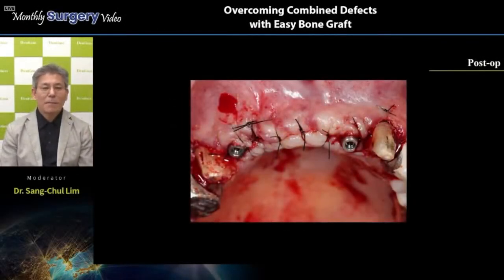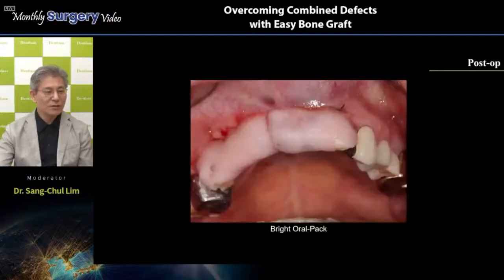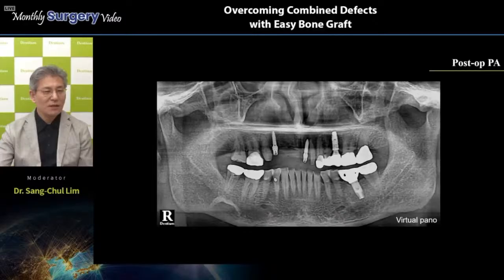Okay, thank you for waiting. So now we are going to see the post-op intraoral view. After suture, we can see the very nice, stable flap closure and the implant insertion situation. A Bright oral pack was applied to this surgical field. And in the post-op panoramic view, the Bright TL was inserted in the number 14 and 21 areas.